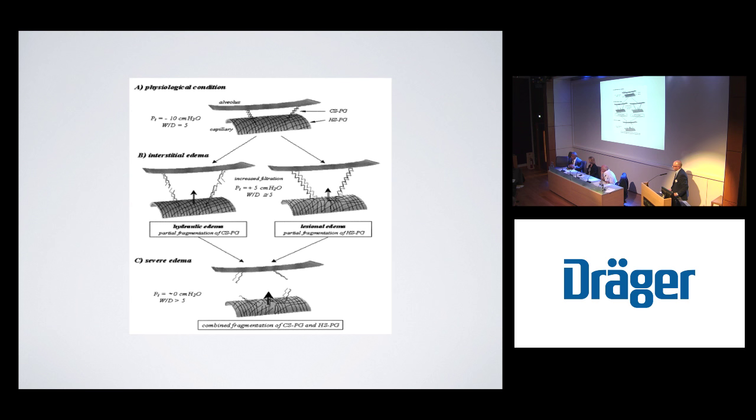In fact, we just published a paper last week in Intensive Care Medicine, and the title of the paper is Occult Ventilator-Induced Lung Injury. What we were able to do is simply show that when you take the PEEP up after you produce alveolar instability, same sort of mechanism, the PO2 goes up in a linear fashion as you increase PEEP. The alveolar stability does not, and it actually plateaus, and it's really hard to regain alveolar stability. So what we commonly use is PO2, thinking that the lung is okay, but you have X-ray abnormalities, you have a lot of other subtle clues that perhaps the distribution of ventilation is altered, the relationship of how gas is distributed in the lung.